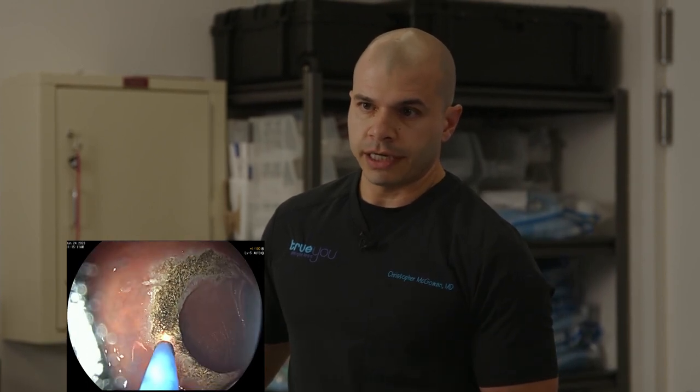First question is from Mark on Facebook. What size are you going to make the pouch now? Yeah, so the final size that we'll aim for in general is about 8 millimeters. We found in our practice that that provides the optimal results with the least rate of complications or stenosis, and we will talk about those things.